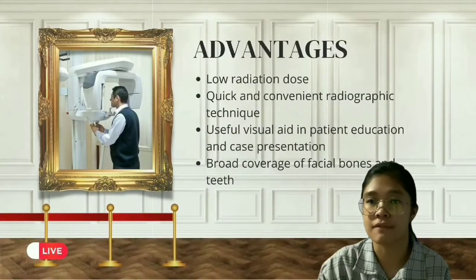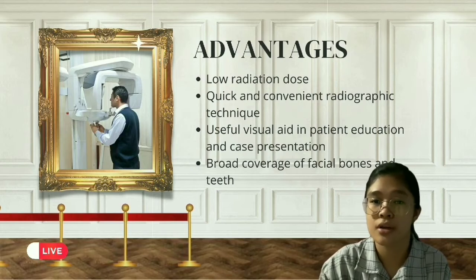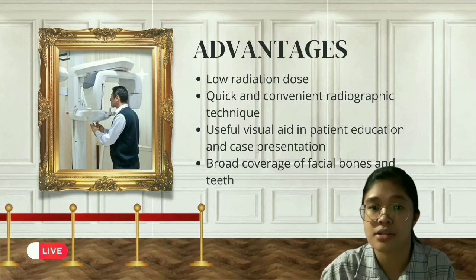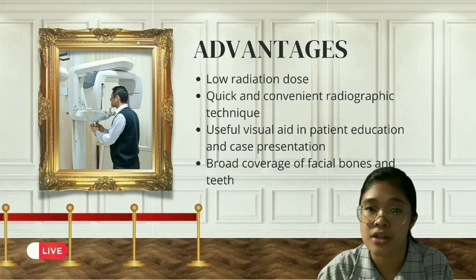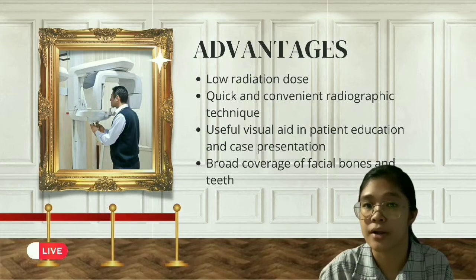Moving on to the advantages of panoramic radiography. First, it has a low radiation dose. The effective dose may be lower than a full mouth survey in some cases. Second, it is a quick and convenient radiographic technique because the positioning of the patient is relatively simple and only minimal expertise of the radiographer is required.